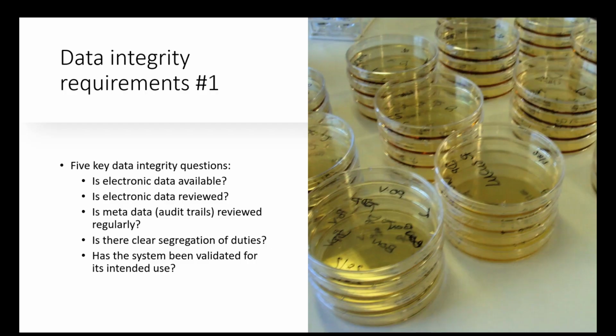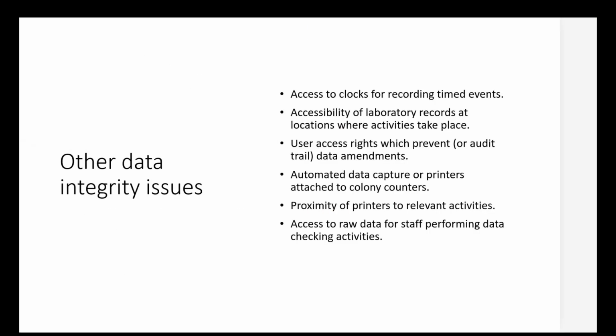And there are a host of questions, and 5 which come to mind are: is the electronic data available? Can it be accessed from wherever it's been archived? Is the electronic data reviewed, and what levels of controls and passwords are around that? Are audit trails reviewed regularly? Is the metadata assessed? Is there clear segregation between the person responsible for operating the instrument and a separate independent administrator? And how has the system been validated for its intended use?